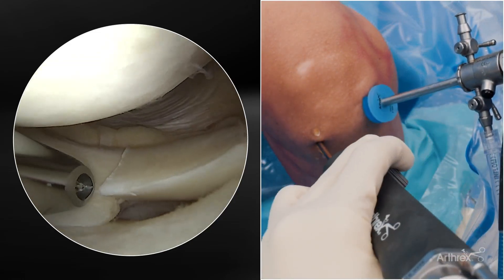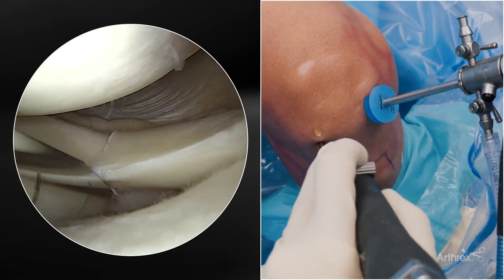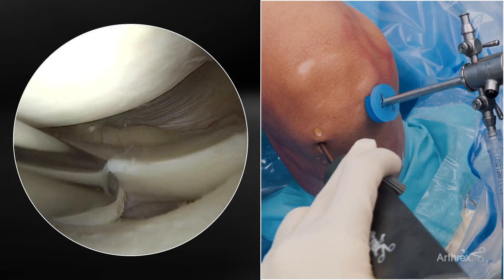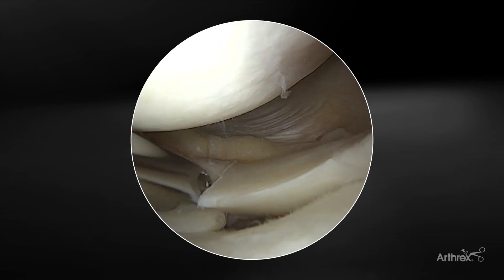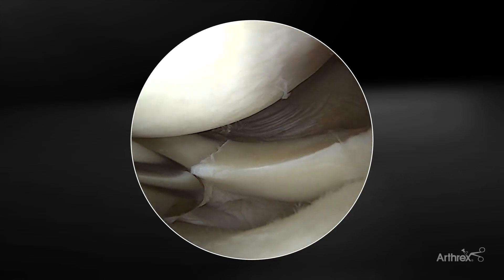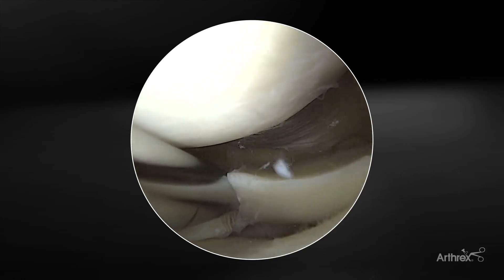I like to use these atraumatic, very small instruments — like the torpedo or the curved 4-0 shaver — to prepare the meniscal-capsular junction or tear edges. I'll typically just use it on forward, no suction. But in these challenging cases, you can use a rasp as well to freshen up the tear edges and enhance the biology and ultimate healing.